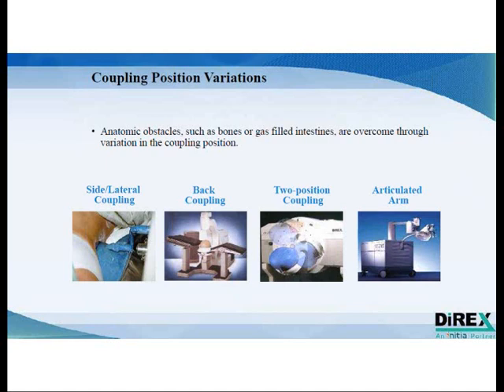Here you can see a very good example in the left side picture of a patient, of the coupling of a membrane with the patient's skin. As you can see, the patient's skin is a bit shiny. This is because you apply the ultrasound gel to avoid any air pockets, air formations.